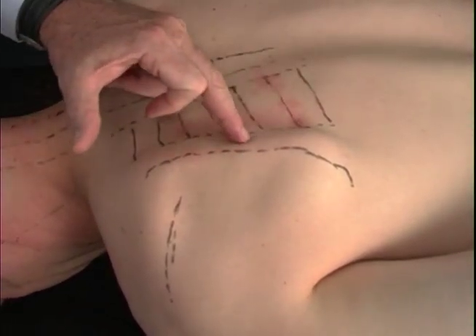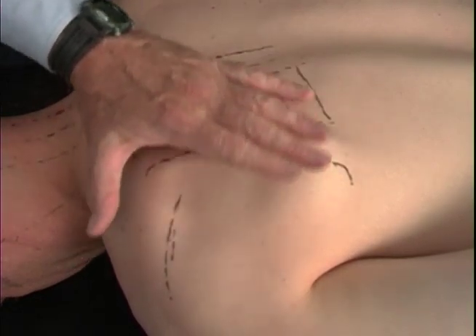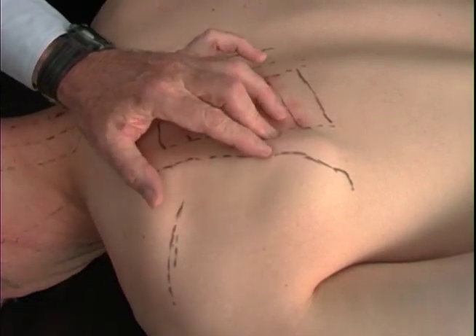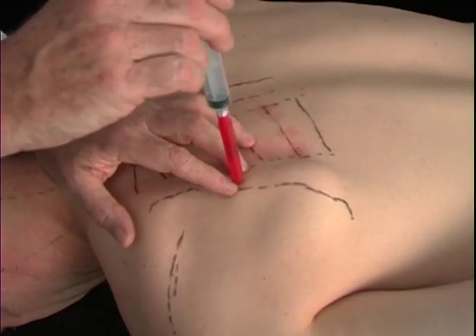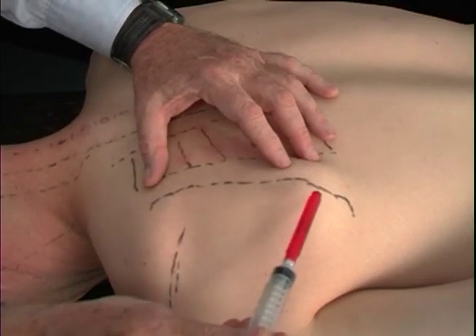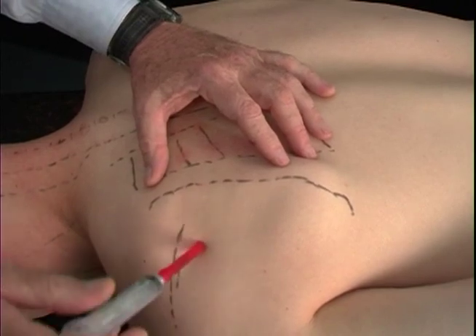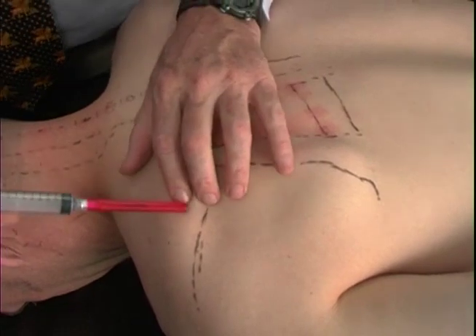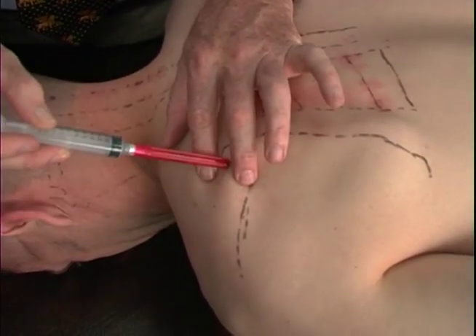But the border is now different from where our line was because we've changed our anatomy, so that we now have to move medially, and in the same manner we lock our fingers on the border of the scapula and come right into that border. Now a much easier and safer injection because the scapula is lifted up off the lung. Sometimes we will choose, if the patient's tender, to inject right across the scapula, but more frequently the area of tenderness is along the border and along the spine of the scapula, which also has now shifted into this area.